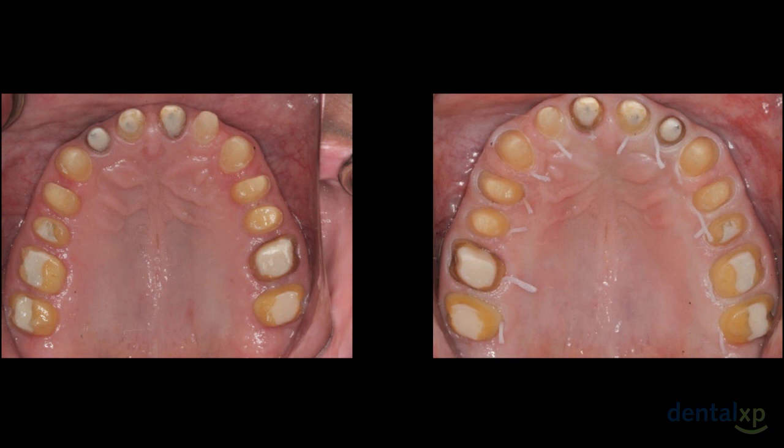In this case, a 5 to 7/10 millimeter chamfer was placed by Dr. Howard Chaslin, a phenomenal prosthodontist in Sarasota, Florida. He is going to be placing all Emax restorations with the exception of 2 and 15, which will be full coverage gold restorations.